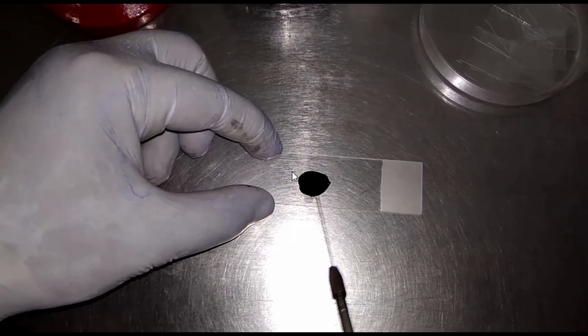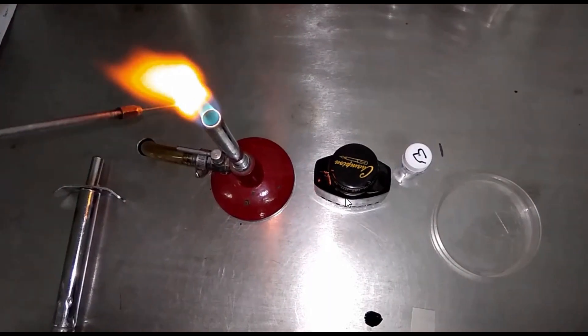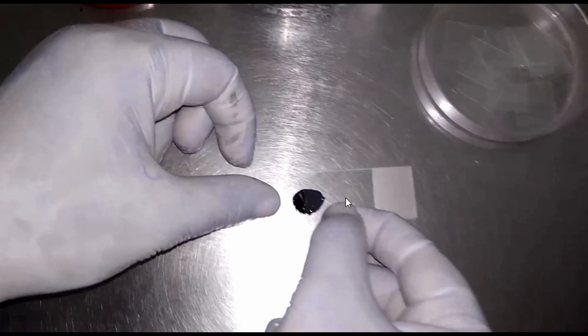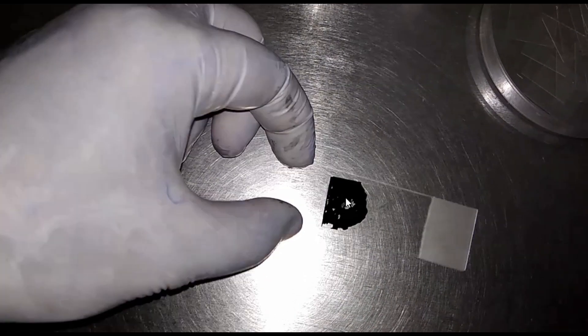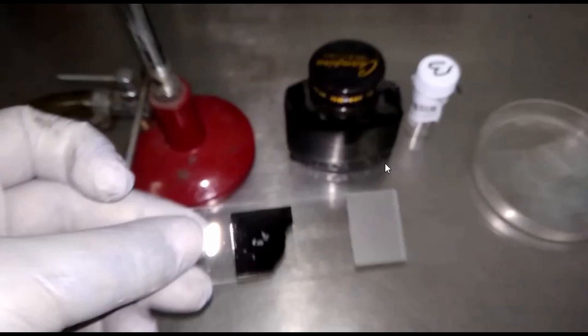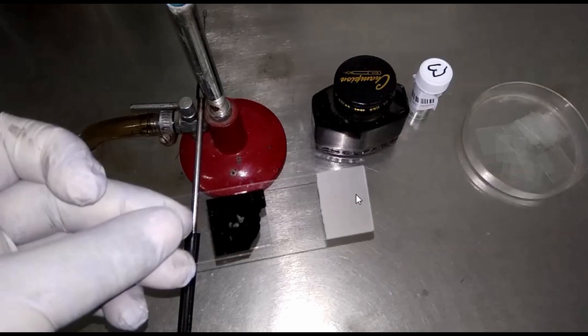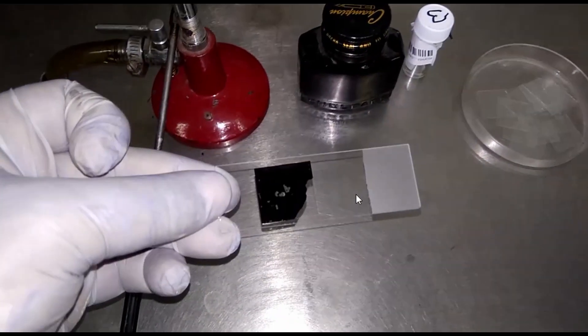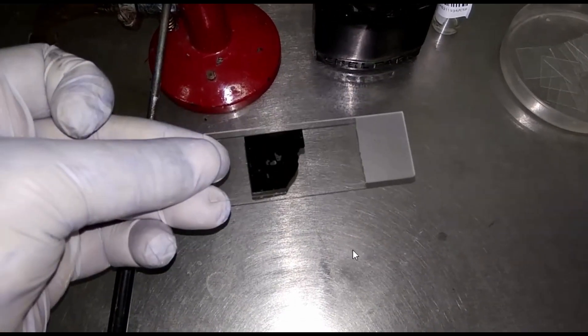Mix properly, now apply the cover slip in this way. We have prepared the India ink preparation. Now let's go to the observation under microscope.